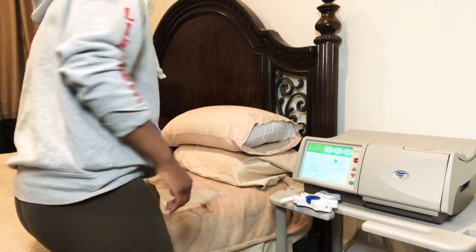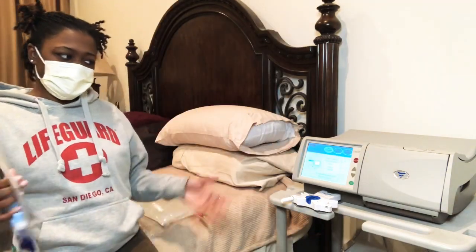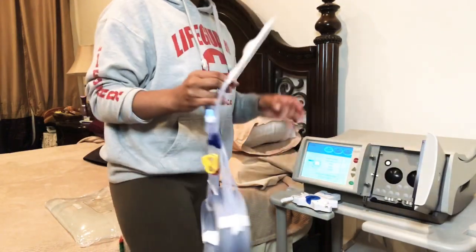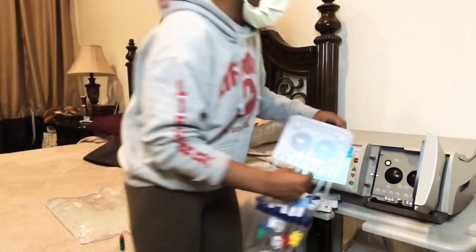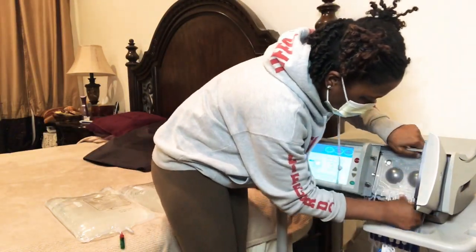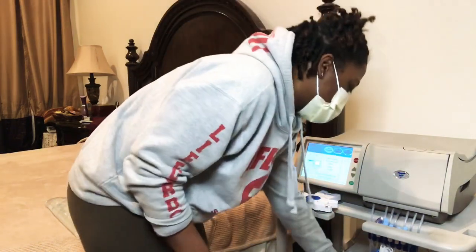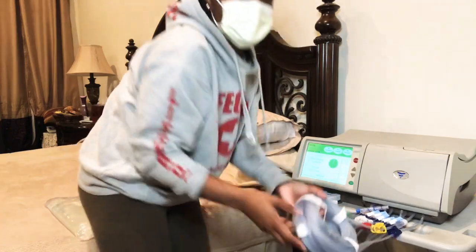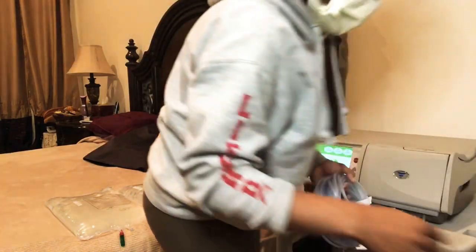So as this is setting up, you want to go ahead and grab your cassette and get it ready. You can go ahead and take your vitals and stuff like that while you're waiting. So you're going to grab your cassette, open up the door, and you're going to see where it lines up with the notches inside. Then you want to go ahead and close it. And then I pull this forward on top of the thing so it's just easier to access. And then we're gonna remove all these tags. They're just to keep the wires neatly organized.